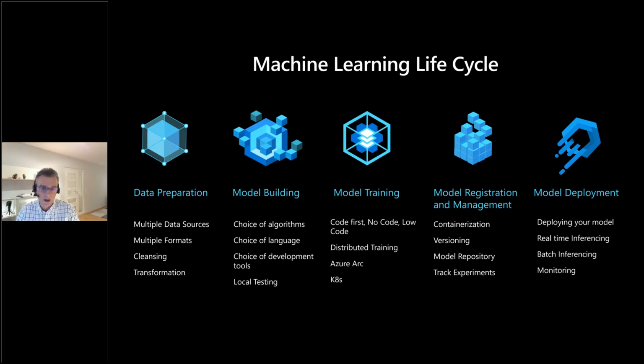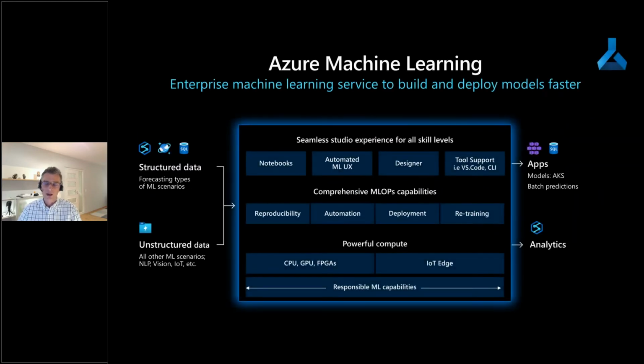So no AI is 100% accurate. So we want to include human in the loop scenarios. For example, if a physician finds out that there was a misprediction, they should be able to flag these kinds of issues to leverage that in a continuous retraining loop. So the process does not end with model deployment. We really need some end-to-end management, which also considers this iterative workflow.